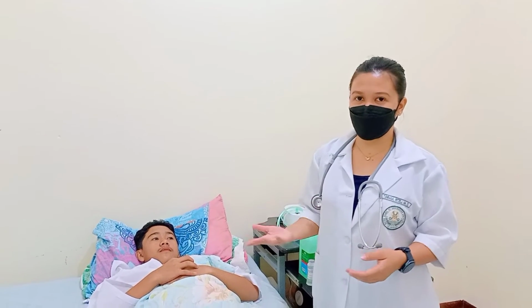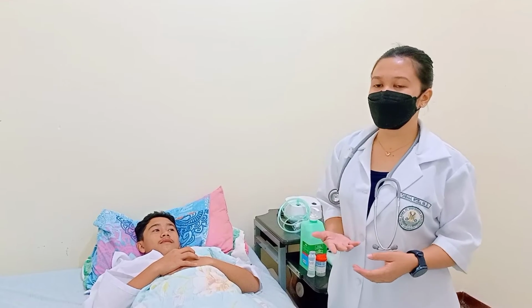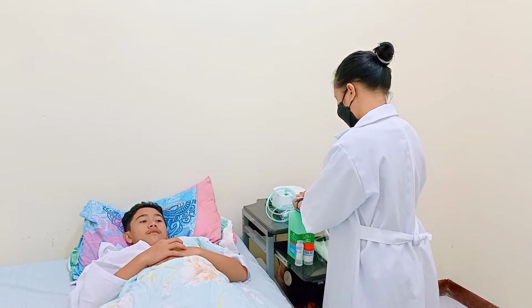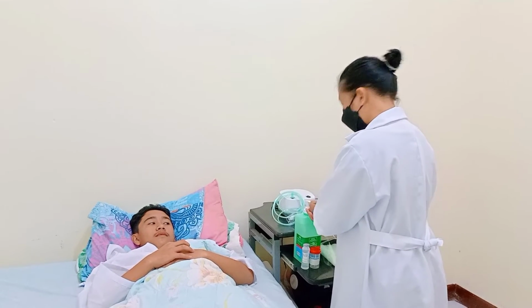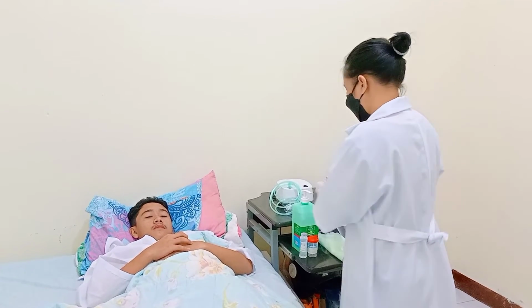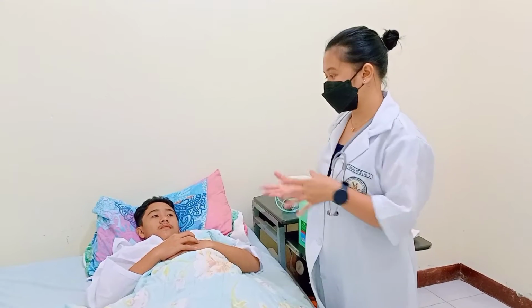Knowing that the procedure will relieve breathing problems also ensures less anxiety and better client cooperation. Next is to perform hand hygiene for infection protocol. Next, provide the client privacy to lessen anxiety.